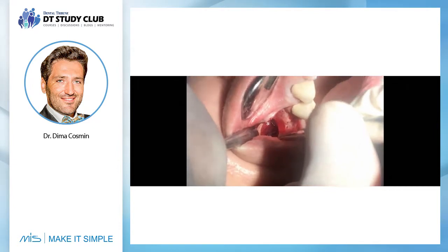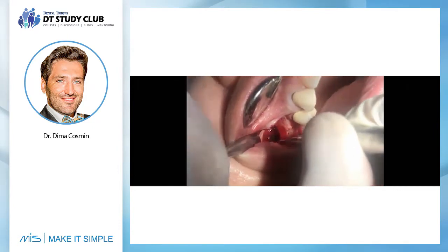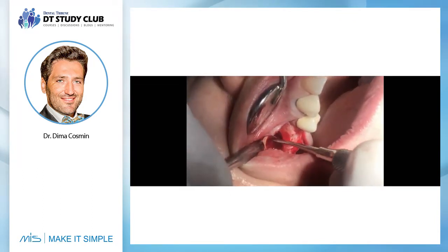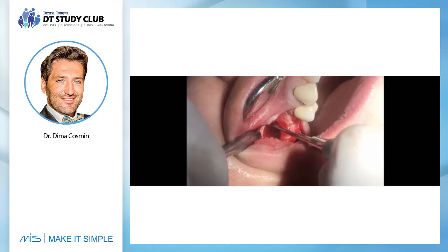We start crestal, then distal, and only after that on the mesial wall.